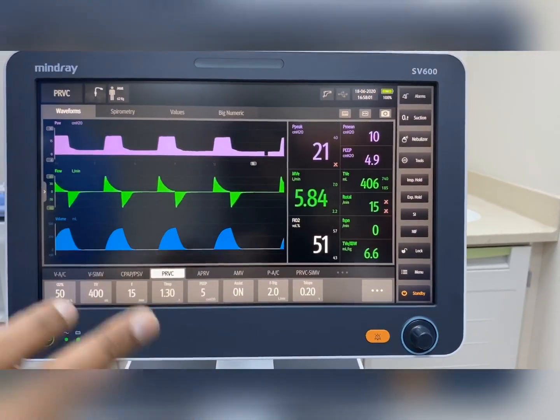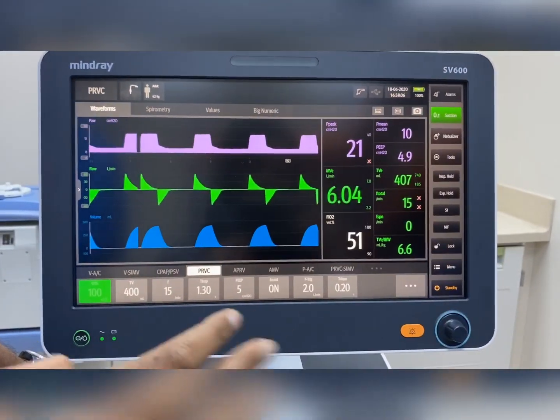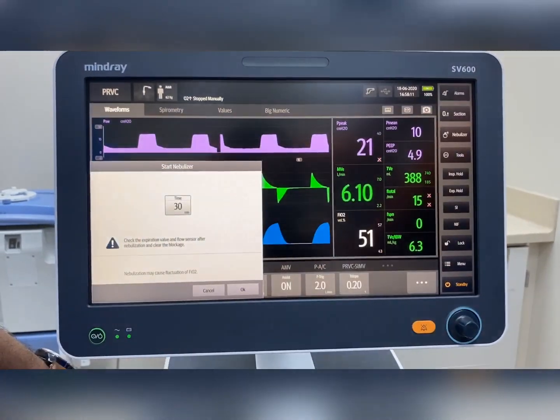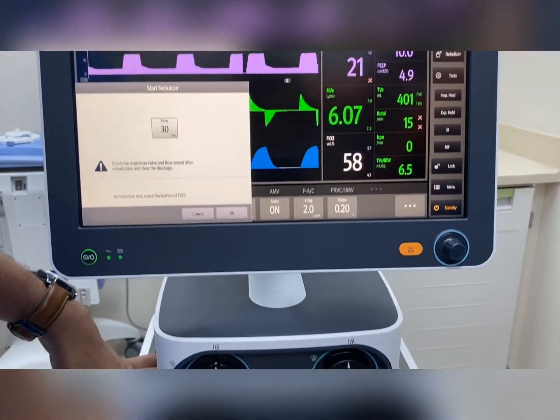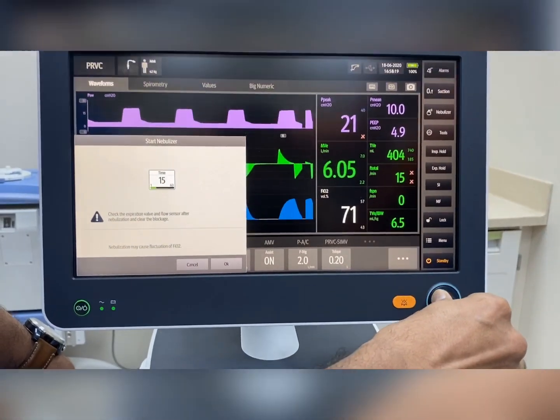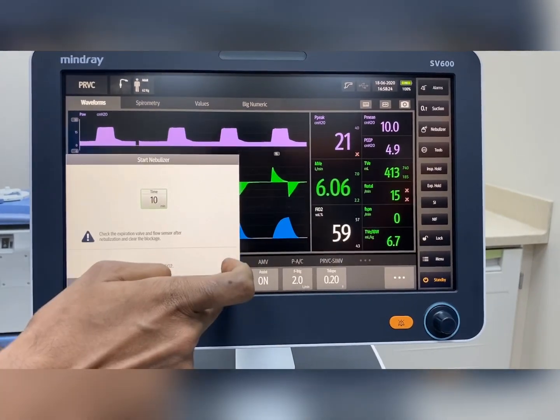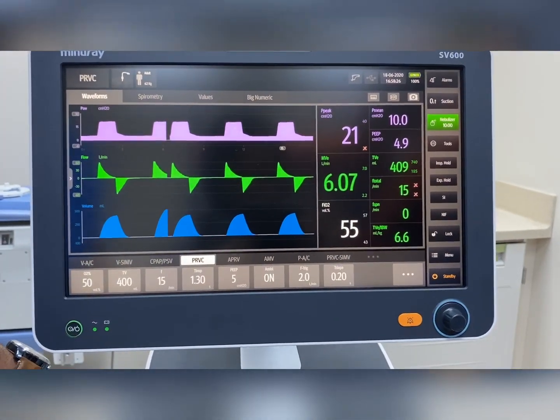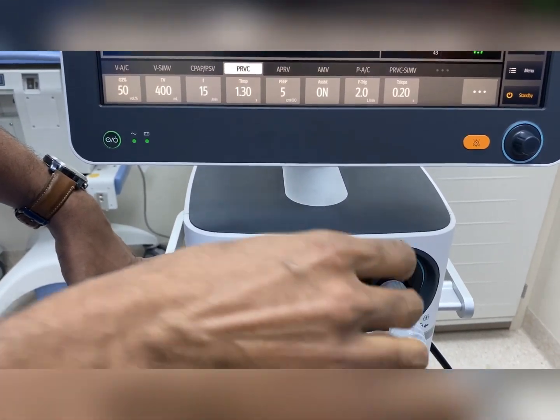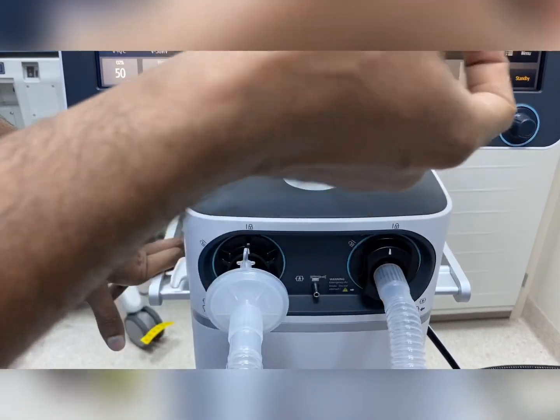When doing suction, like all ventilators, if you select the suction option, the machine will deliver 100% FiO2 for two minutes. Similarly, there is an option for nebulization. If you hook the nebulizer to the machine, you can set the timing — for example, 15 or 10 minutes — and within that time the machine will deliver nebulization. You can see the air coming through the inlet. There is no requirement for a separate nebulizer; it can be hooked directly to the machine.